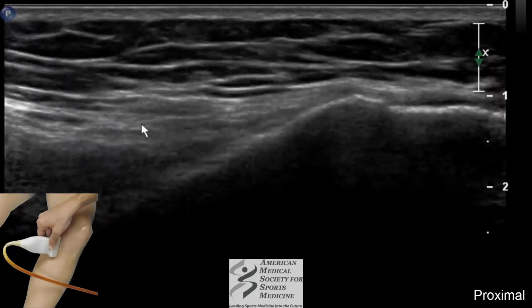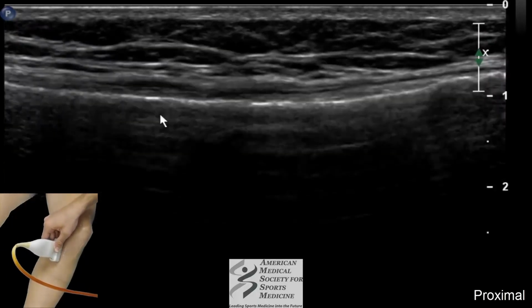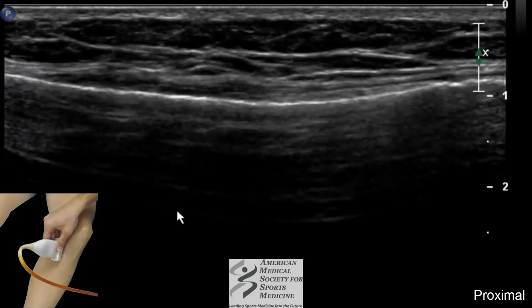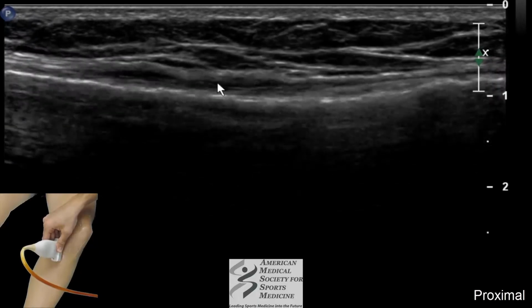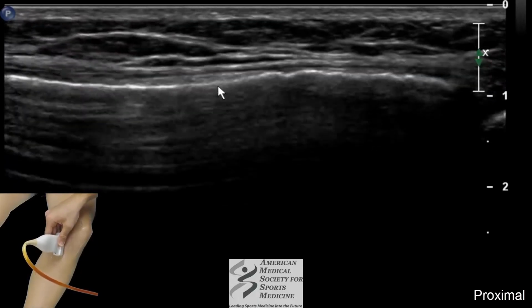You can follow any of these tendons back posteriorly into the posterior aspect of the knee. We can look at those with the posterior evaluation. So you can do that if clinically indicated. Otherwise, if there's only pain anteriorly, you can visualize them at this location and look for any pes anserine bursitis. So we'll come back up proximally.